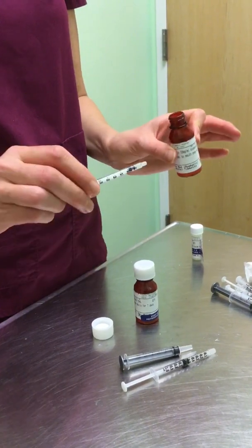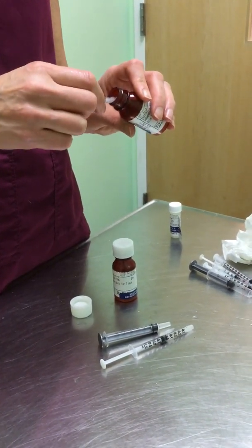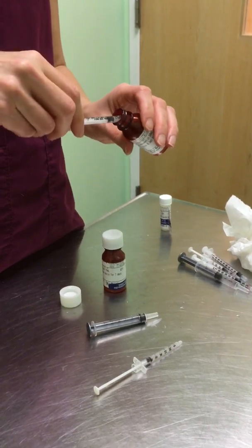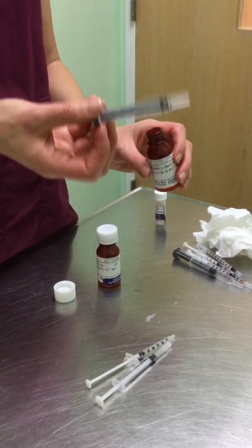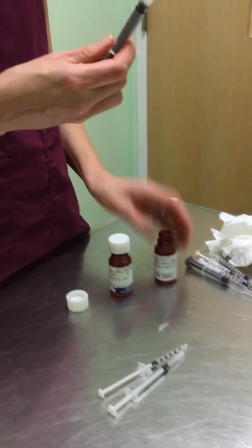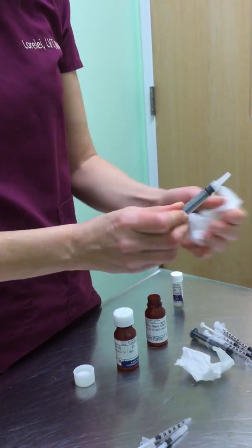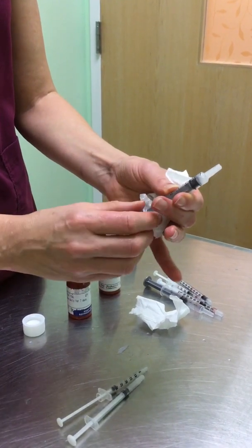Now, those of you who are paying attention will notice 0.3 mils. I could either use this tiny syringe and draw up, wow, all the way to the 0.3, fill it up. I could use this medium-sized syringe and draw it up to the 0.3, like this. Or if I again have that really large parrot or a rabbit or something that I want to use a larger syringe for and I want 0.3, let me get the air out here. You're going to be to the 0.3, the third little line, 0, 0.1, 0.2, 0.3, all right?